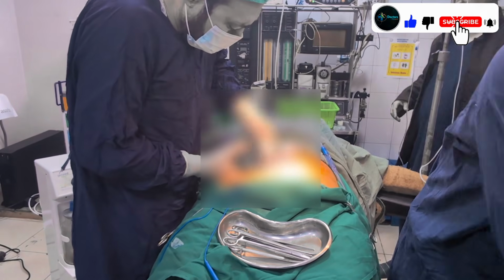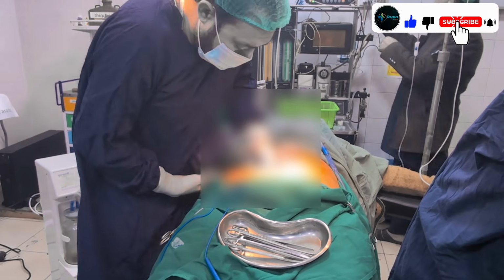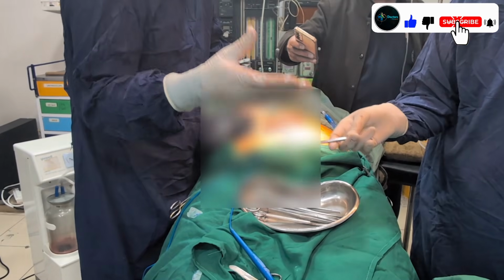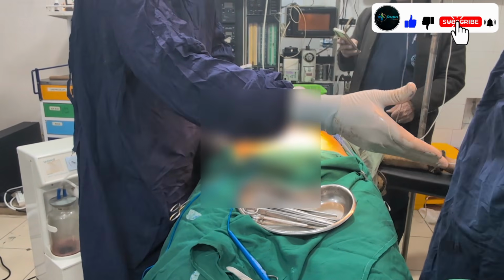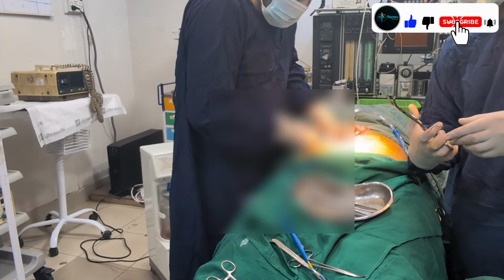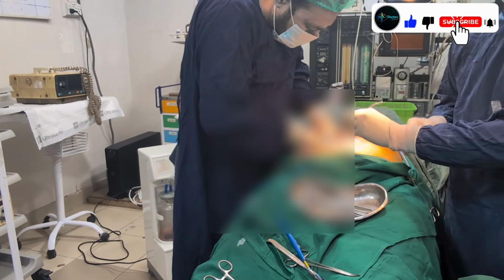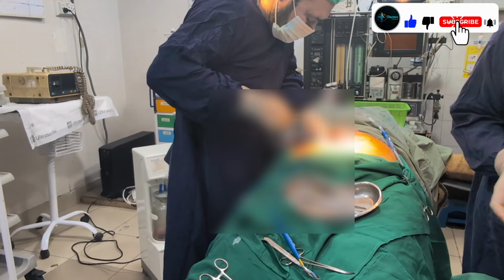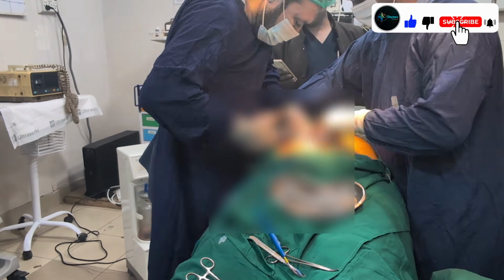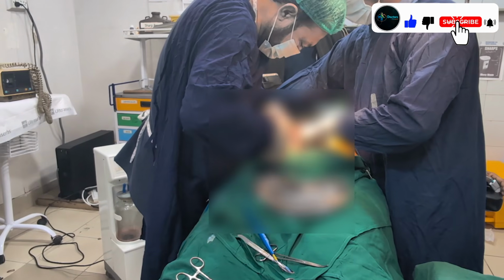Oh my God, what is this? We have never seen anything like this before. This looks very large, in my opinion. It may weigh at least 7 to 10 kilograms. Right, sir. Even the surgeon looked surprised and concerned.